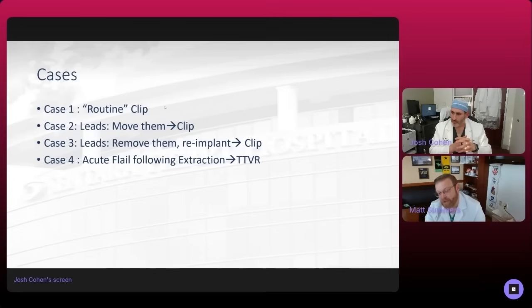It's because this is a very collaborative procedure, really dependent on two people working at high levels to get a good result. Yeah, I would echo that, pun intended. Working with Matt and one of our other partners, Parth, I think the way we were trained, you're not heavily reliant, but there's an understanding of fluoroscopy angles at the same time as echo, and maybe we'll talk a little about that, or you can shed some light on it in some of these cases.